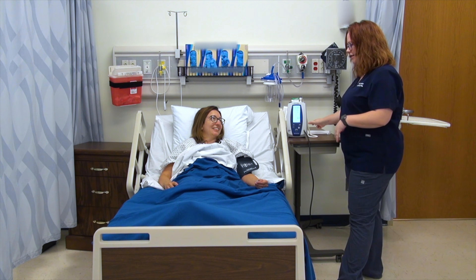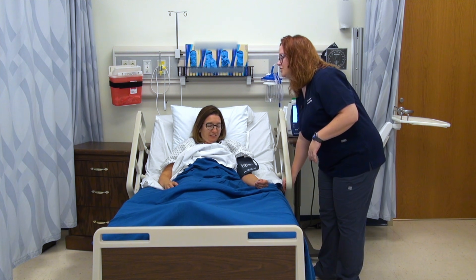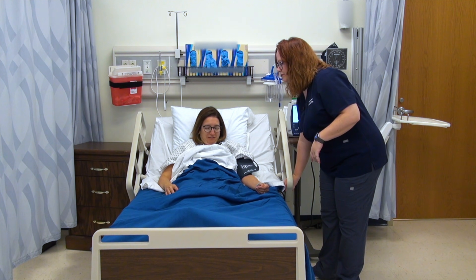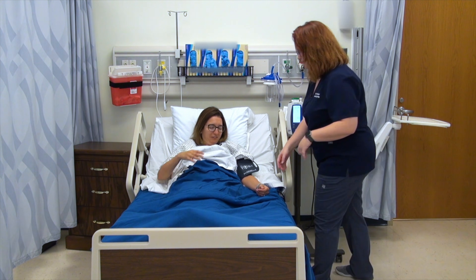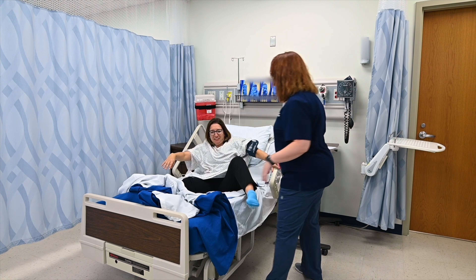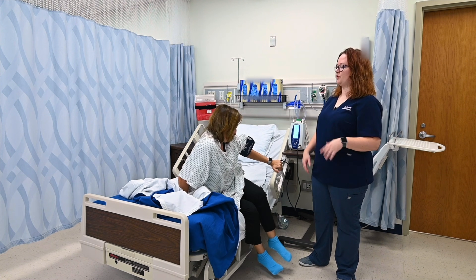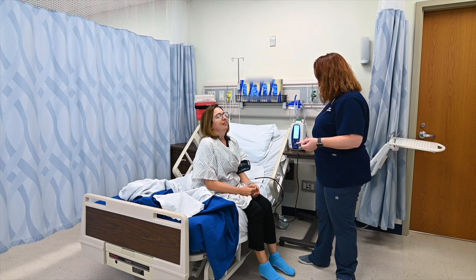We'll just leave that cuff on you. I'm going to have you swing your legs over the side of the bed and just sit with your feet touching the floor. Can we get some apple juice when we're done? We'll get some apple juice when we're done. Let's just sit up on the side of the bed — don't try to get up. I just want you to swing your legs over. We're going to sit like this for a couple minutes and then go ahead and take your blood pressure again.